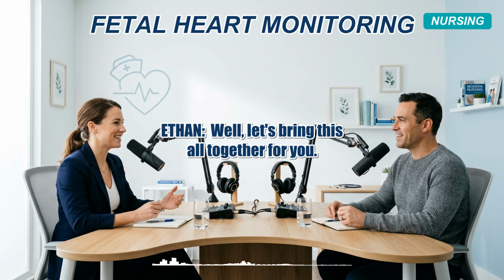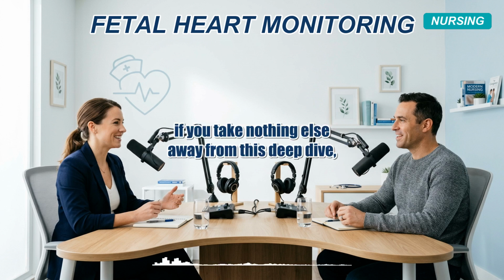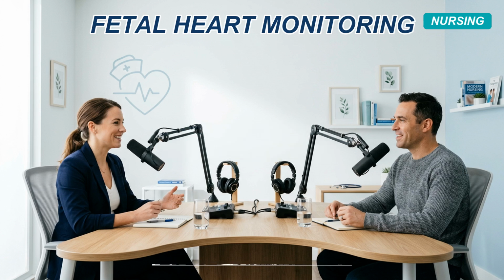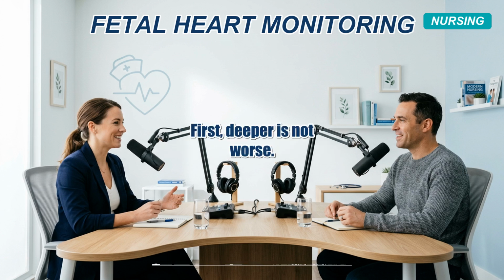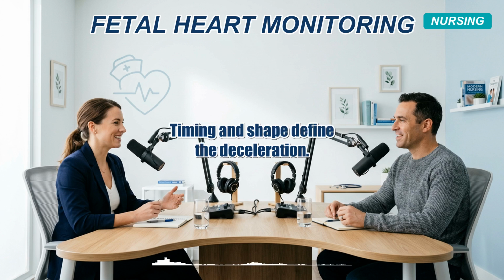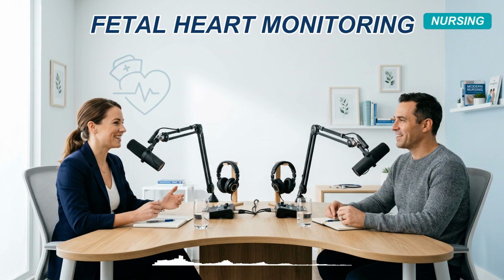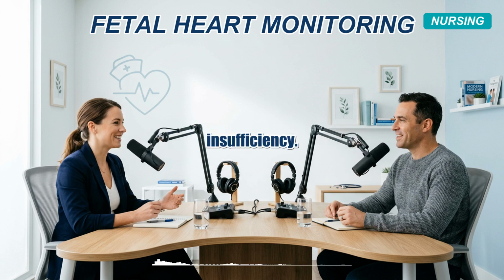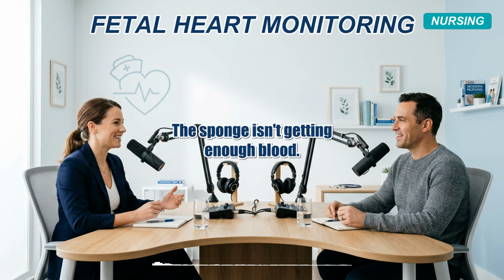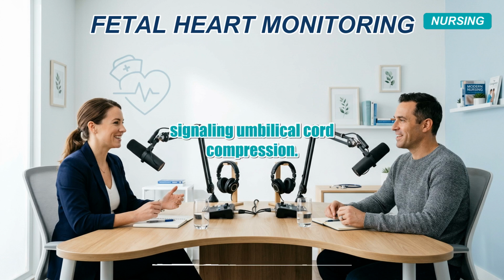It really is. Well, let's bring this all together for you because we have covered a massive amount of ground today. If you take nothing else away from this deep dive, remember these core rules of the squiggly lines. Right. First, deeper is not worse. Timing and shape define a deceleration. Early decelerations mirror the contraction and are caused by benign head compression. Late decelerations lag behind the contraction and signal uteroplacental insufficiency. The sponge isn't getting enough blood. Variable decelerations are abrupt and jagged, signaling umbilical cord compression.